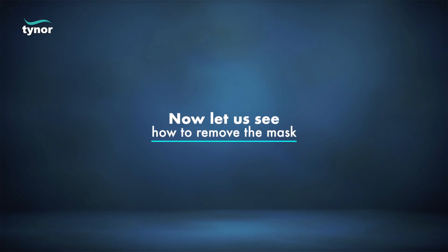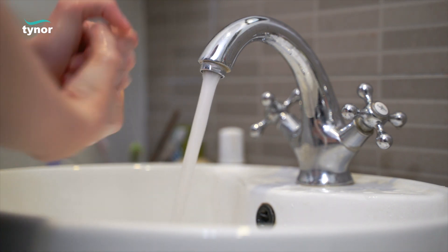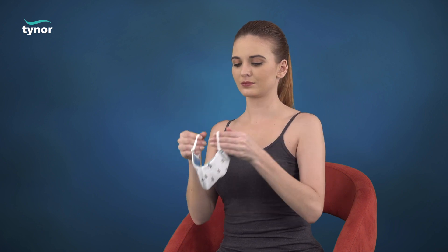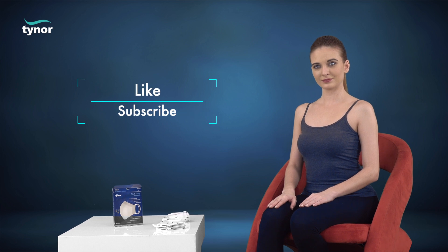Now let us see how to remove the mask. Wash your hands with soap, then carefully cup the mask in hand to maintain its position on the face. While still holding the mask in position, pull out the ear straps on either side and remove the mask.